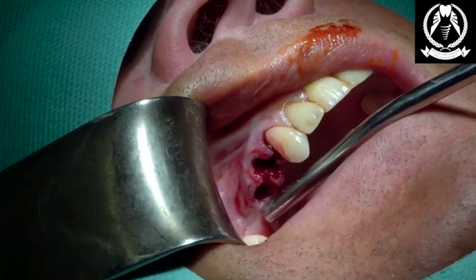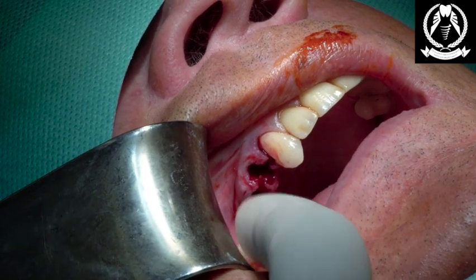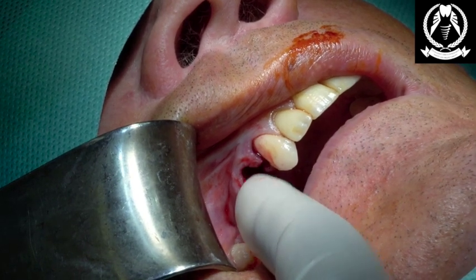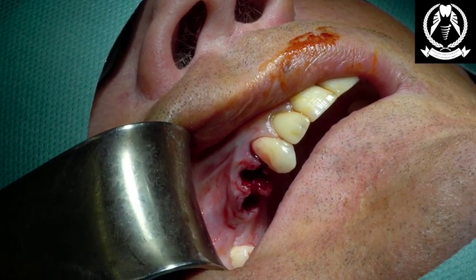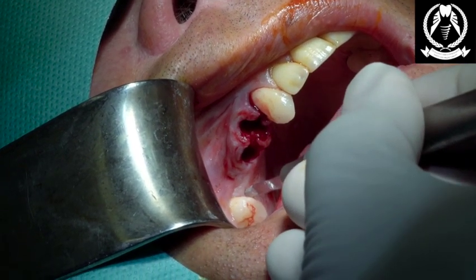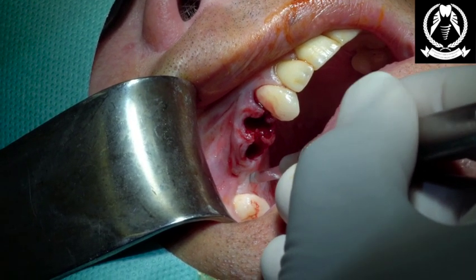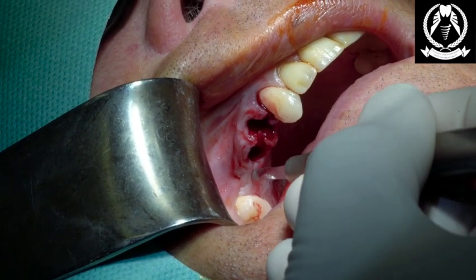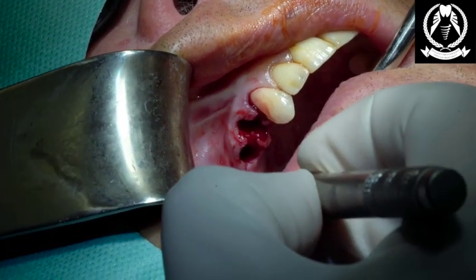Okay, great, great. Okay, so now we've done the extractions of the first premolar and the second premolar roots. We're going to place an immediate implant in the position of the 4, and we're going to do a sinus lift in the position of the 6 and place another implant. So I'm starting off with an incision slightly off the crest, going towards the palate. Alan, are you okay? And the incision comes forward. I'm using a double-sided blade. It's one Morton blade there. Modified Widman just to release the tissues.